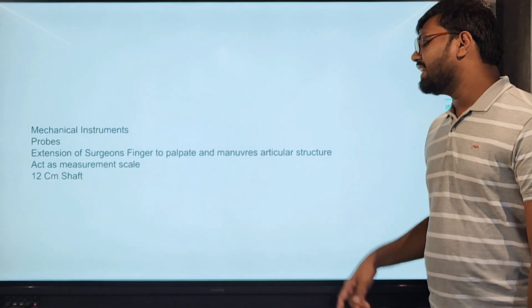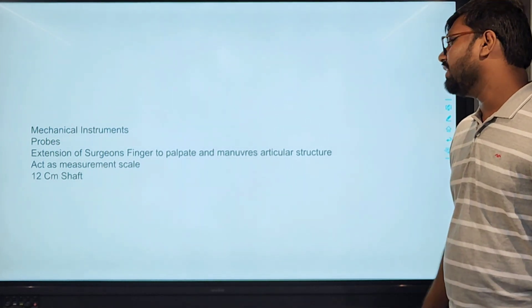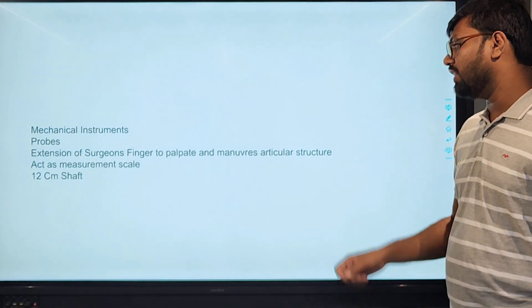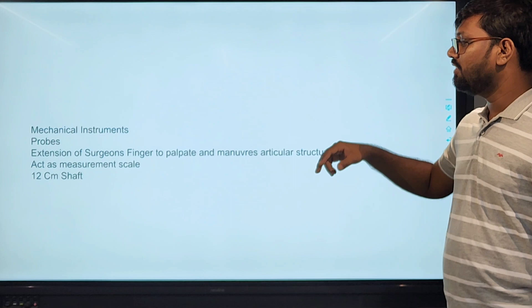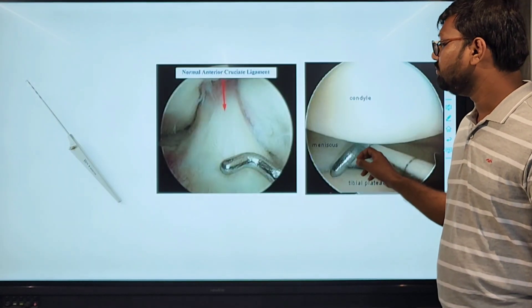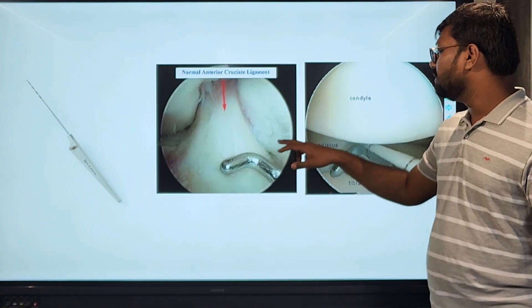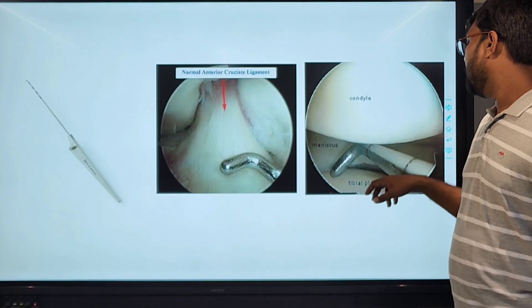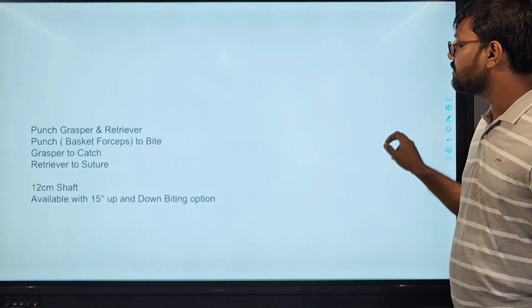Mechanical instruments — probes: the probe is an extension of the surgeon's finger to palpate and manipulate the articular structure, and for measurement. They have built-in measurement scales up to 5 centimeters. This is the probe, and this shows probing of the normal ACL. We can also check the undersurface of structures with it.